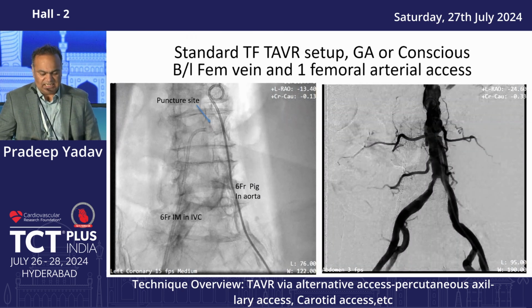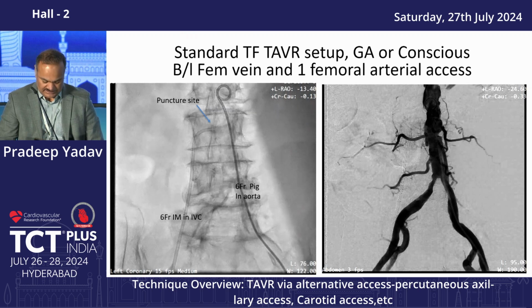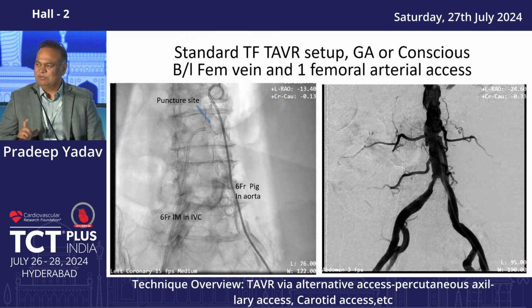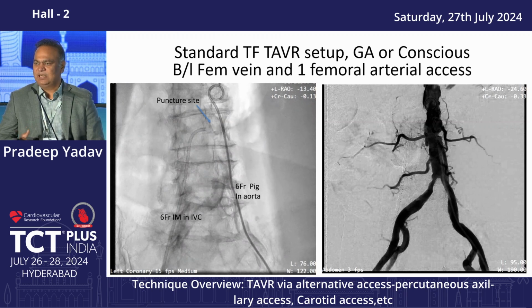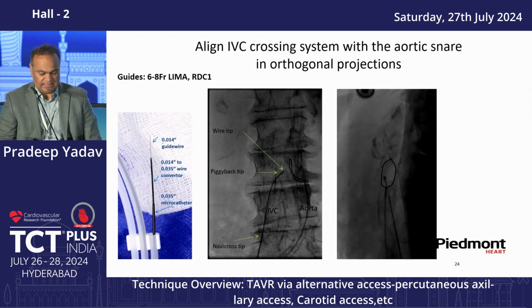This is a baseline aortogram. Once your catheters are placed, you take an aortogram just to see what the aorta anatomy is. And you can use it as your reference baseline and compare it at the end of the case and see what is bleeding and what is just a branch artifact.